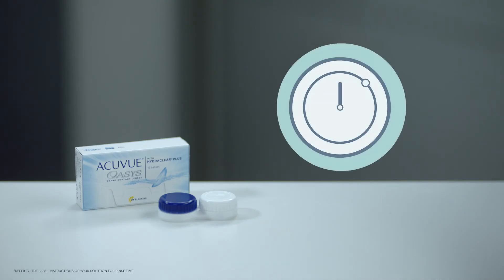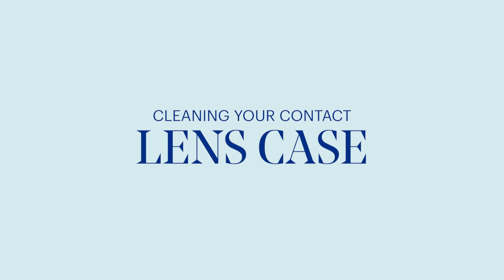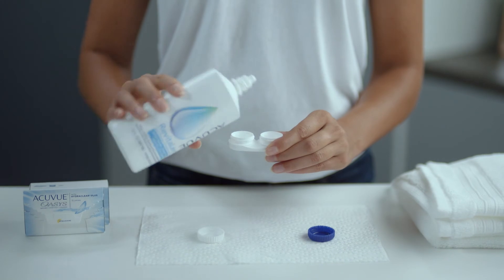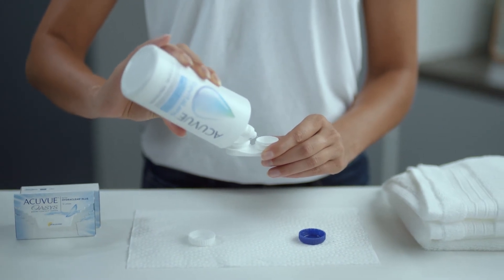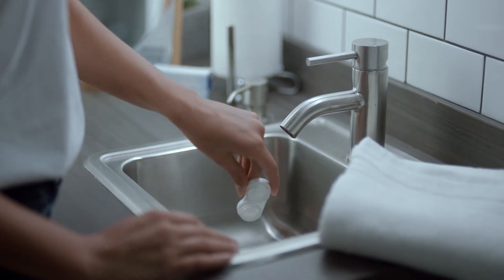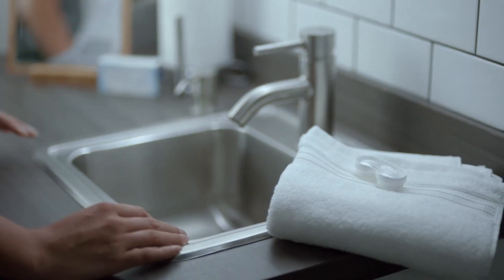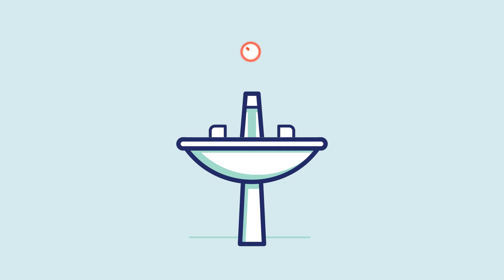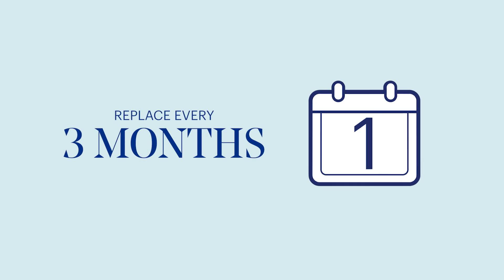Now that your contact lenses are clean, it's important to disinfect them. Simply soak them in disinfecting solution overnight for a minimum of six hours. Keeping a clean contact lens case is as important as washing your hands, so get in the habit of rinsing yours with solution after each application. Once rinsed, shake any excess solution out of the case and let it air dry upside down on a lint-free towel. Never use tap water or reuse solution — it can significantly increase the risk of a serious eye infection. For this reason, it's also wise to replace your case every three months.